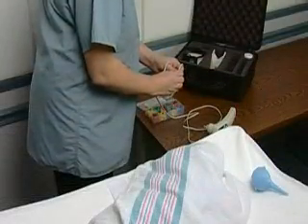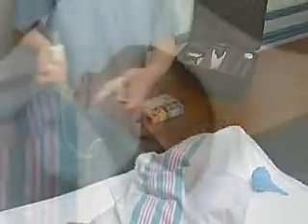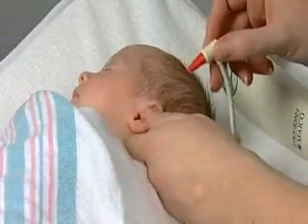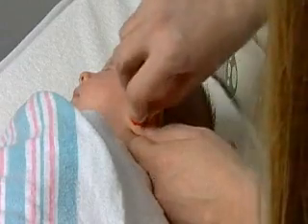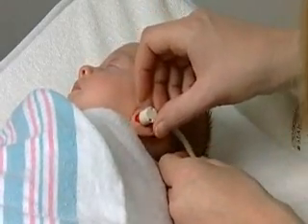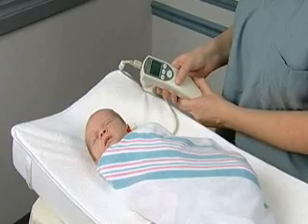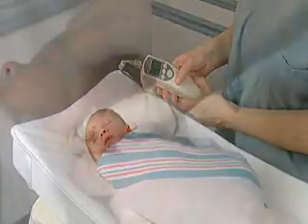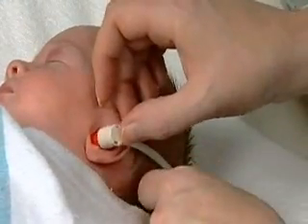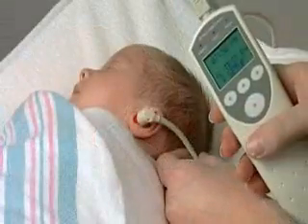To properly place the ear tip in the newborn's ear, first pull down and back on the pinna. This will straighten the ear canal and make probe placement more effective. Now gently place the probe in the newborn's ear, making sure the probe is at the proper angle. As a general rule, the probe should be angled toward the infant's nose. The infant may startle and move while putting the probe in the ear — this is normal behavior. After waiting a few seconds for the infant to calm down, run the test.